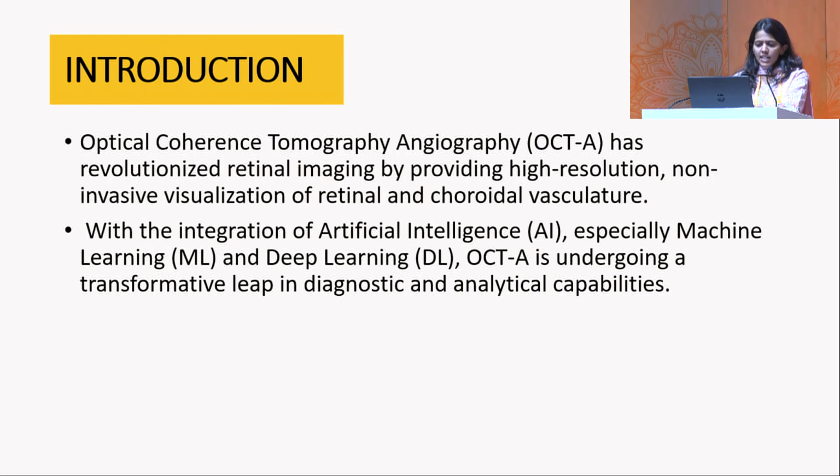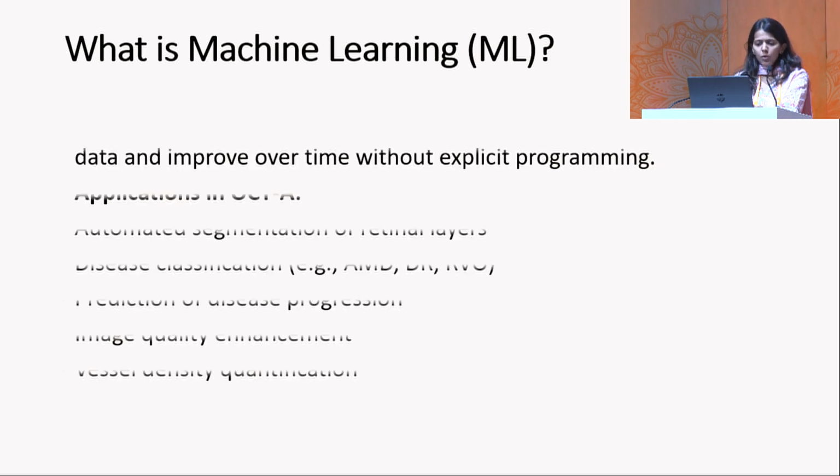I'll be talking about AI innovations in OCT angiography, which is actually a game changer for ophthalmic imaging. We all know that OCT angiography has revolutionized retinal imaging by providing high-resolution, non-invasive visualization of the retinal and choroidal vasculature. Now, with the integration of artificial intelligence, especially machine learning and deep learning, it's undergoing a transformative leap in diagnostic and analytical capabilities. Let's briefly look at what machine learning is.